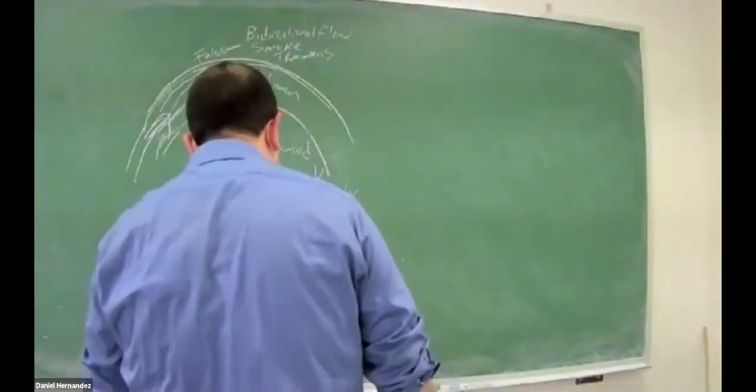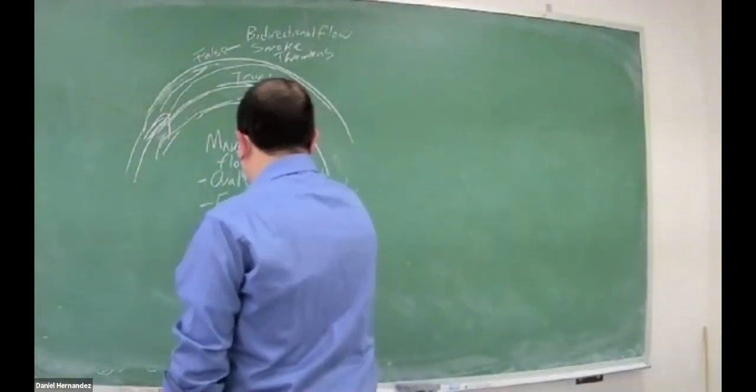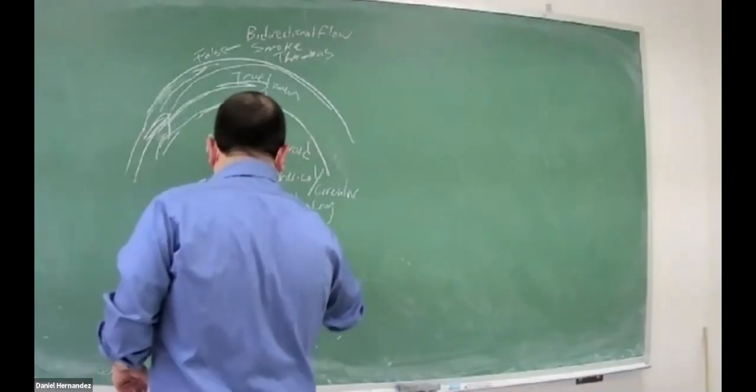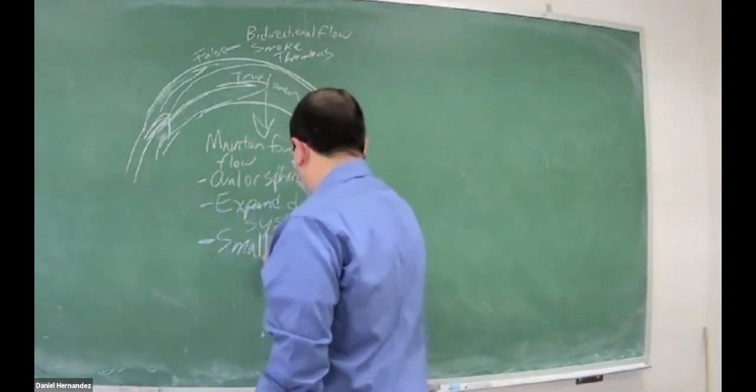True is smaller of the two. Sorry, my bad. The only reason I remember is because I just read it, but then I was like, maybe I'm wrong. No, you're right. It's because of the thrombus formation.